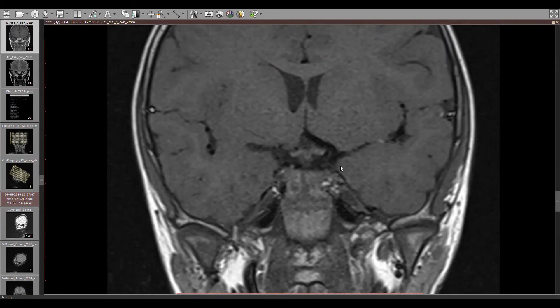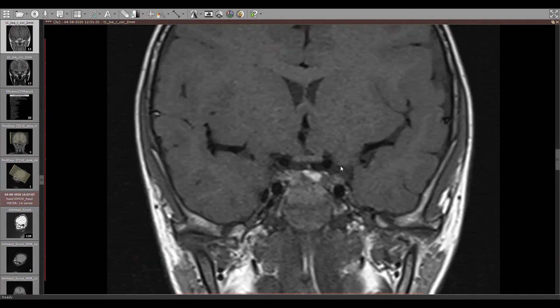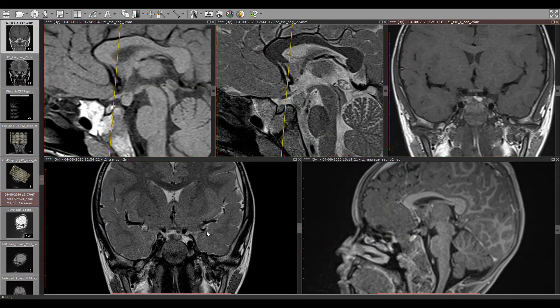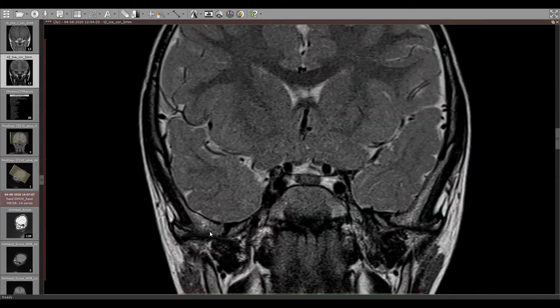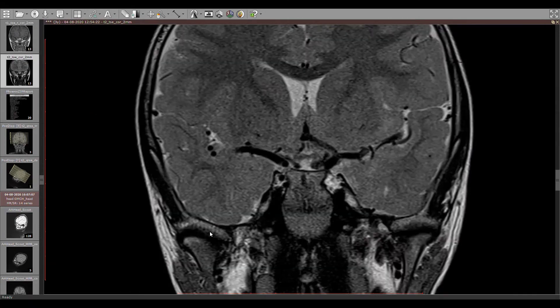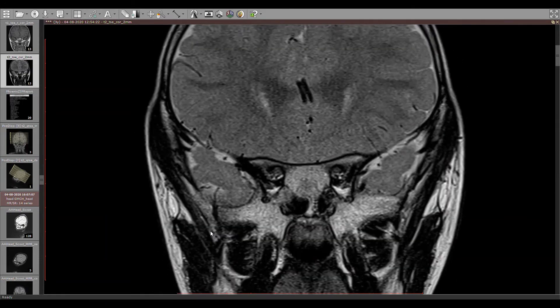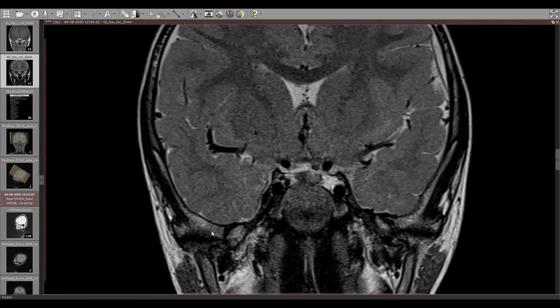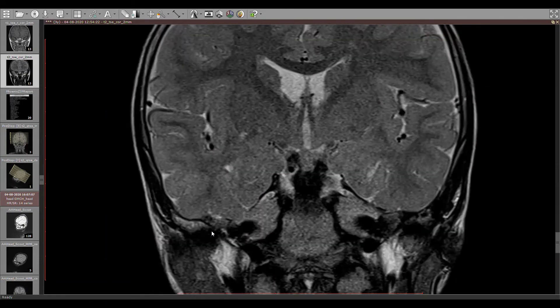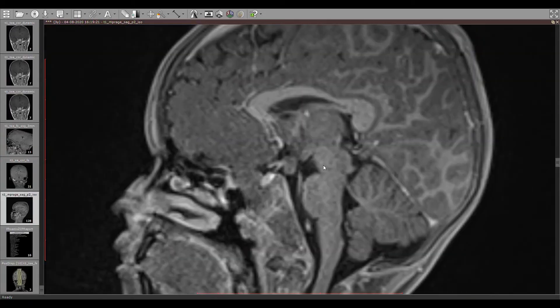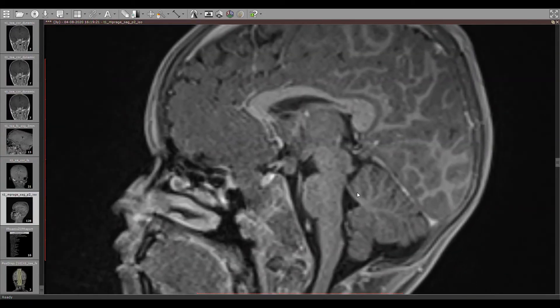Momentarily, we see the stalk and the pituitary gland. Coronal T2-weighted images again show that the lesion is iso-intense. Post-contrast, there is no enhancement within the lesion.